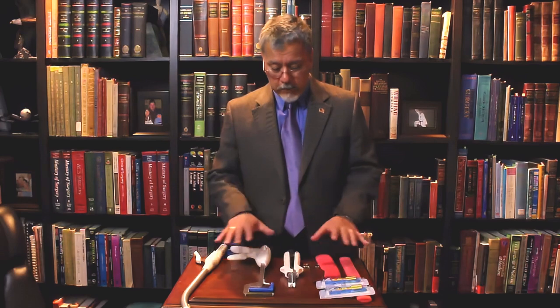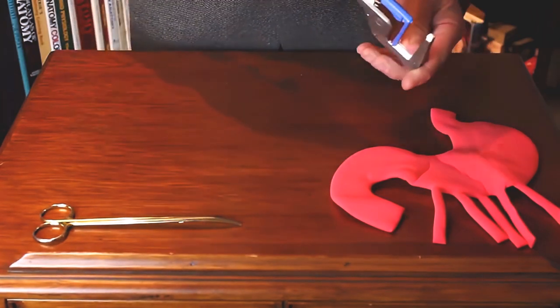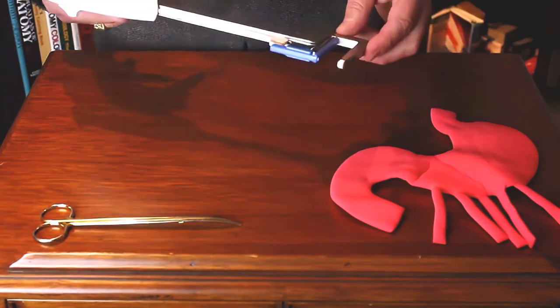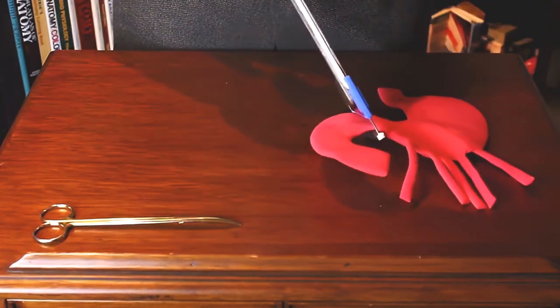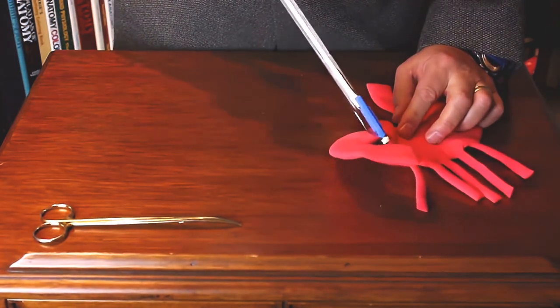But now, let me show you how these three types of staplers are used: linear cutter, linear stapler, and end-to-end anastomotic device. So here we have a linear stapler. A linear stapler has a single double staggered row of staples, and it will close off an organ. The way to use it is that you place it, secure it, close, and fire.